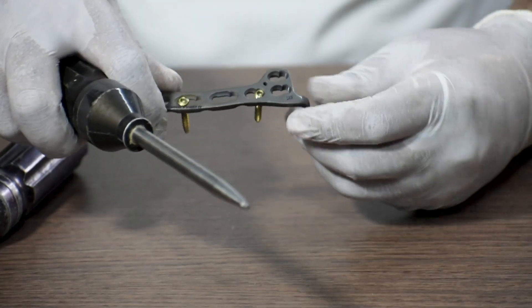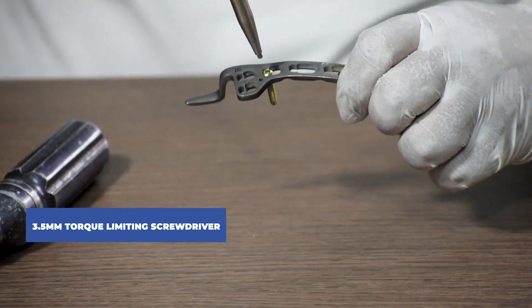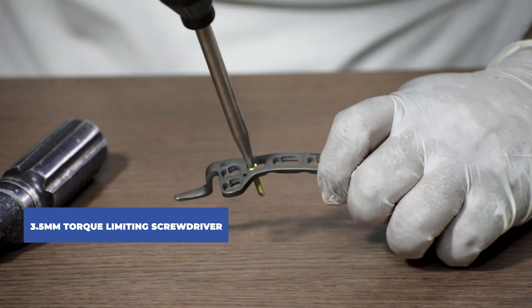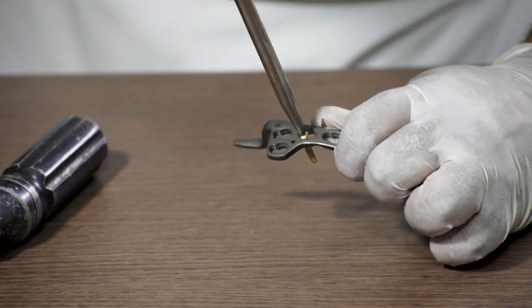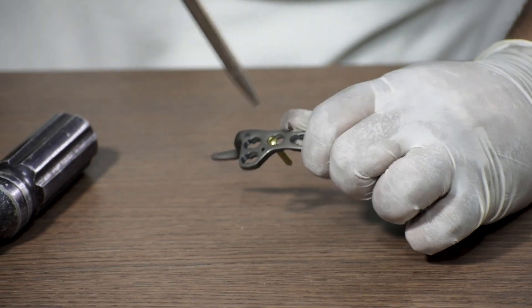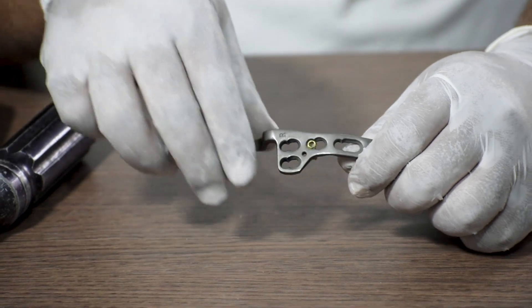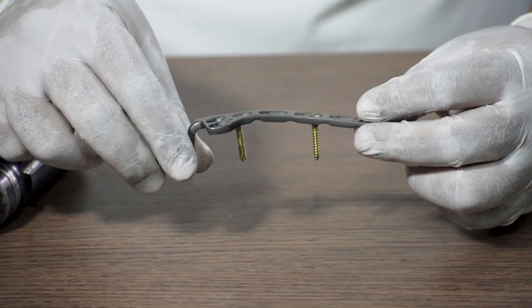Lastly, we check the torque of the locking screw with a 3.5 mm torque limiting screwdriver. As the screws attached are 3.5 mm locking screws, we keep tightening until we hear the click sound — the click sound indicates the locking screw is completely locked with the plate, and we do not tighten it further.